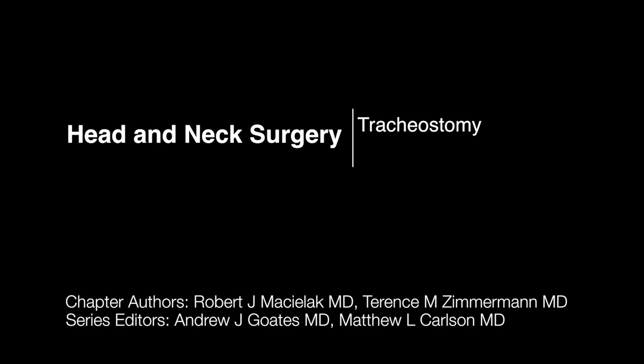This is Dr. Rob Masilak and I will be talking about performing tracheostomy today. This is a young woman who has an unknown neurologic disorder which has caused her to require prolonged intubation, and thus is an indication for tracheostomy.